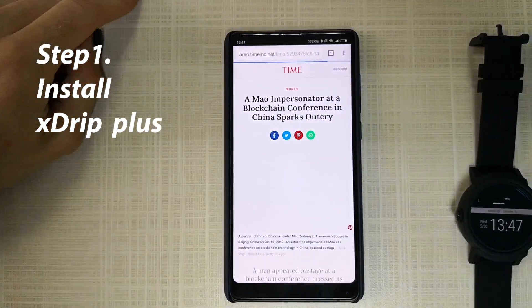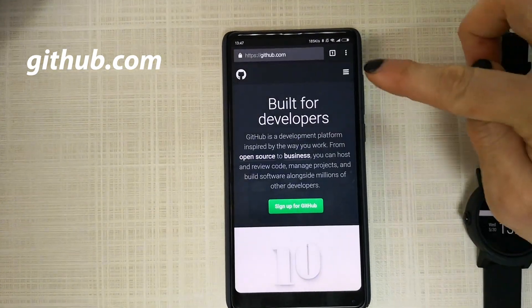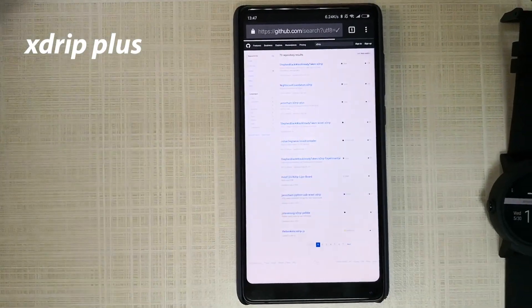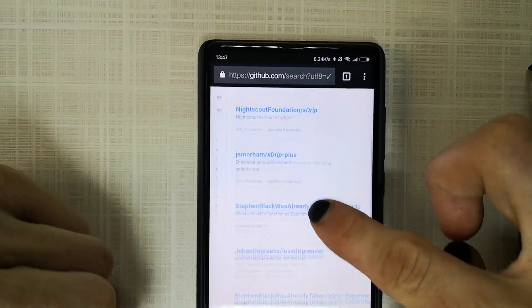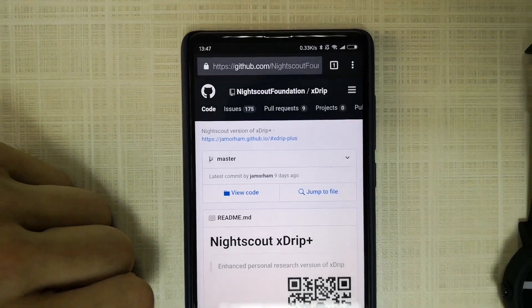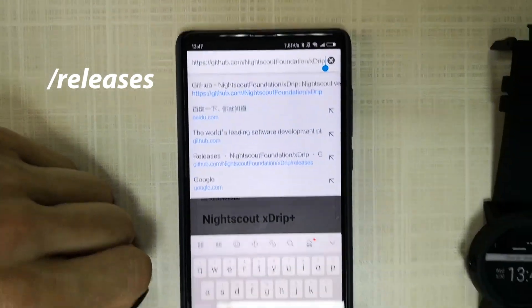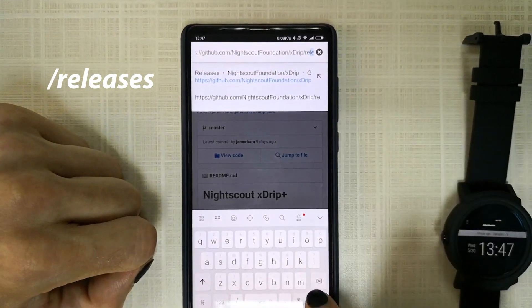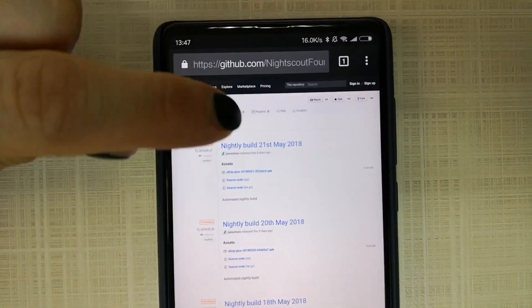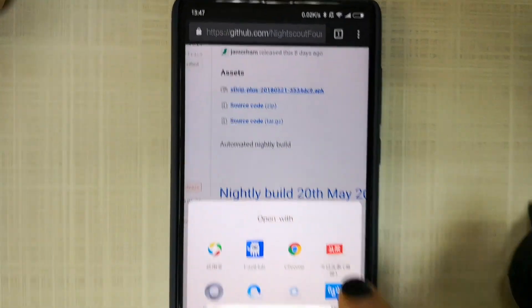Open your browser and go to GitHub. Search for xDrip, find the Nightscout Foundation slash xDrip repository. Go into the URL and type 'releases' at the end. We get the latest build, which is the 21st May 2018 — you will see the APK file here, press download.